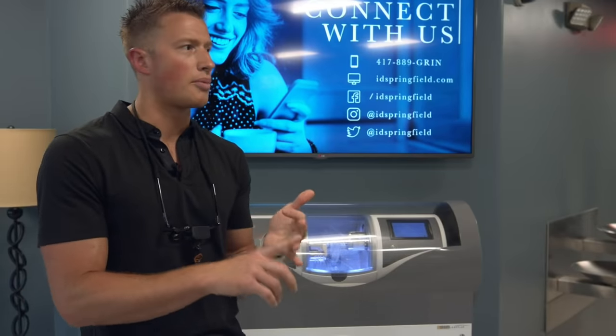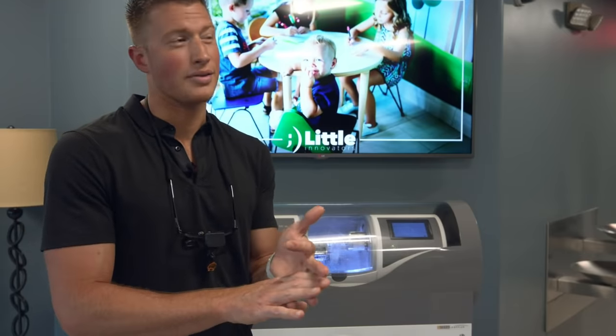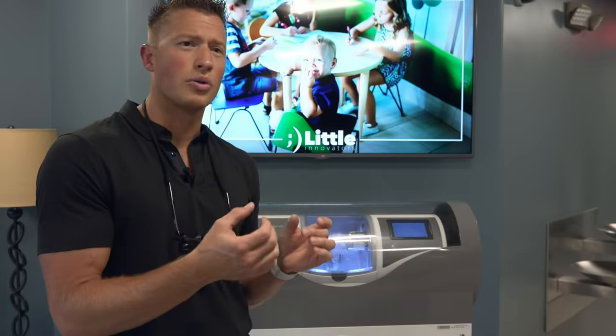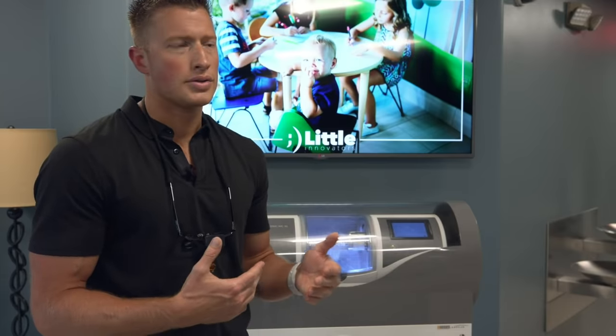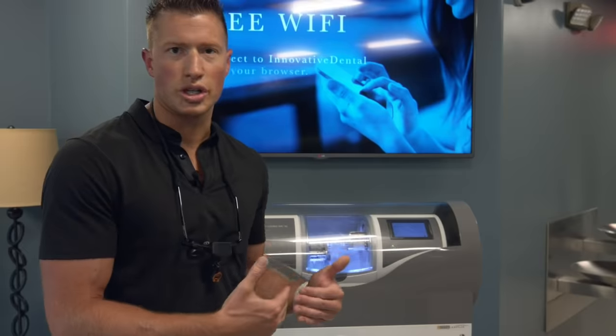That incision alone causes more bleeding, more hemorrhage, a little bit more infection, and post-op pain. The healing time is definitely going to be longer when you have to make that flap and incision. The process of placing the implant is going to take longer. So those are all disadvantages to that older way of surgically placing an implant with an incision like that. And it's also obviously just more invasive.